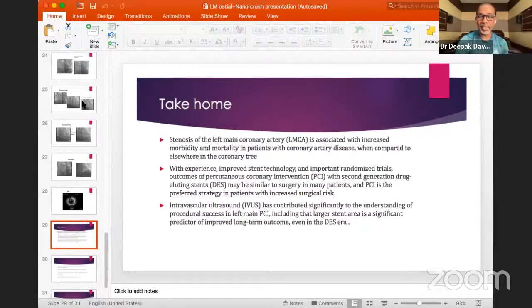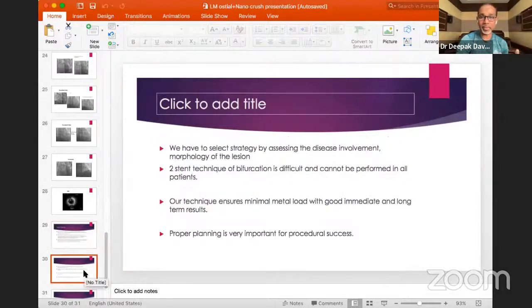And the second important reason is, when you pull out your balloon from the stented segment, that is, you stent the vessel, and when you pull out the balloon, there is every chance that your guide catheter can go into the vessel and deform the proximal portion of the stent. So when you have a wire inside the aortic root, the chances of the stent getting deformed by the guide catheter could also be significantly reduced. So that's something very interesting. Then you did it. It was a very simple way of tackling that.